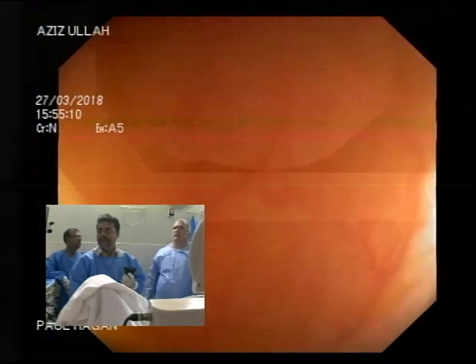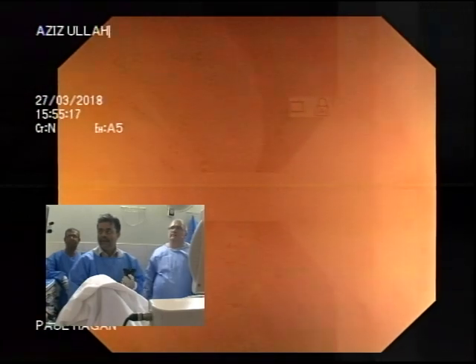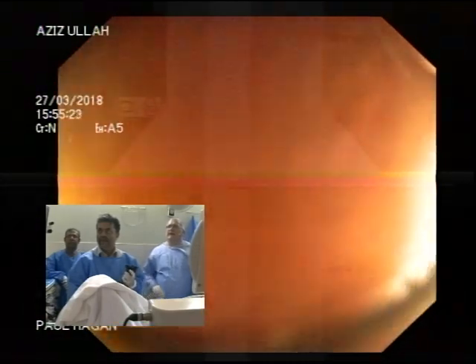Okay, you got into the wall, don't crash. Yes. So you've got to come back. Good man. Good. Come back a little bit further. So we can tell that the bowel wall is under pressure. How? It's white. And why does the bowel wall go white when we go against it? Because of the pressure ischemia? Yeah. So if you know that, why are you doing it?